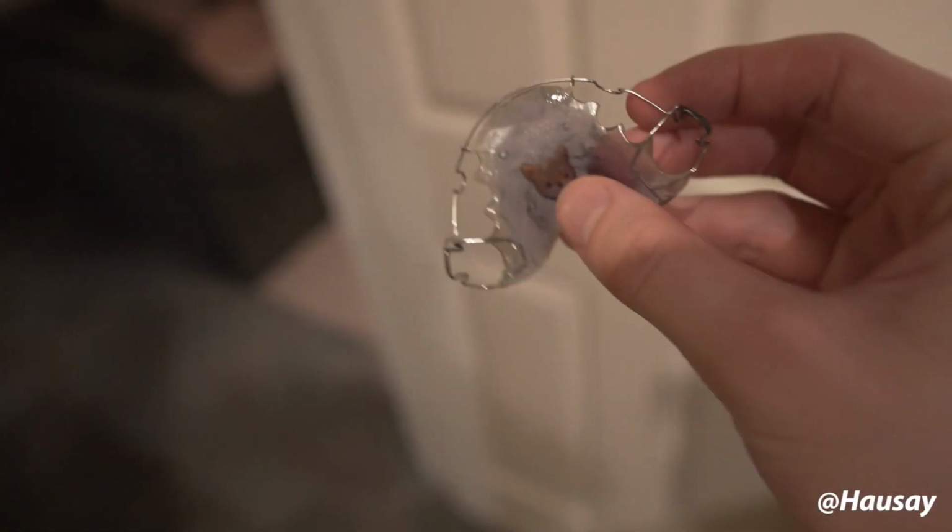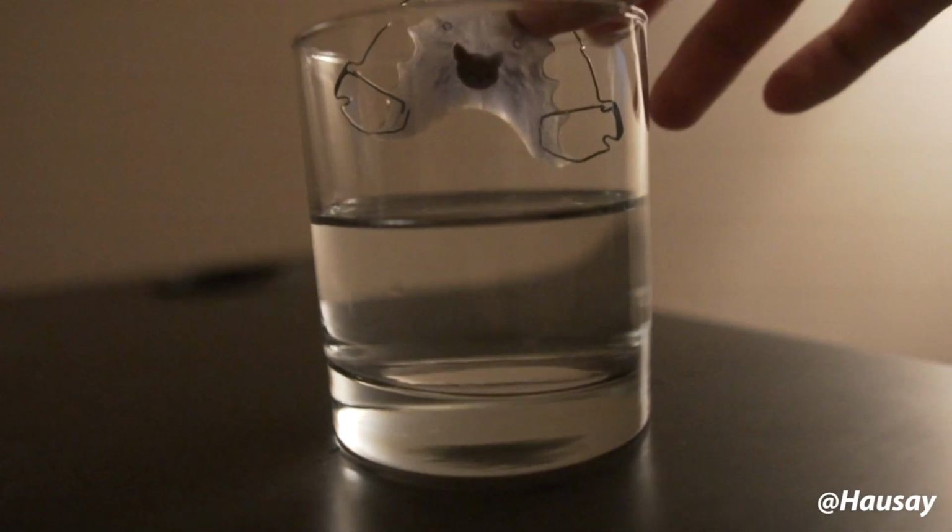But I'm gonna show you what happens once. Let me grab my retainer here. So there's my retainer right now. It's got a bit of buildup on it. Here we go.